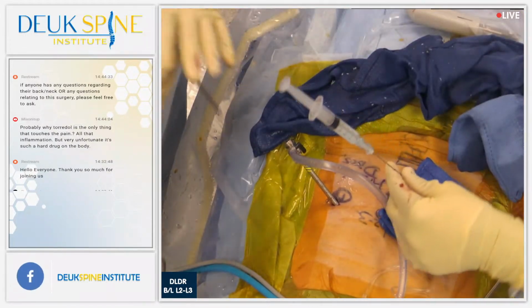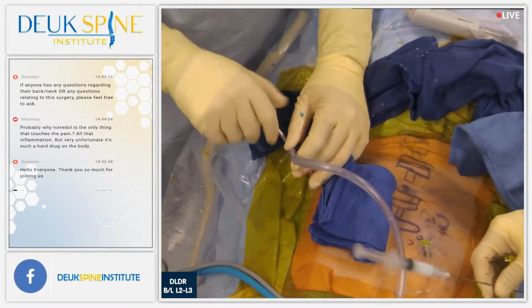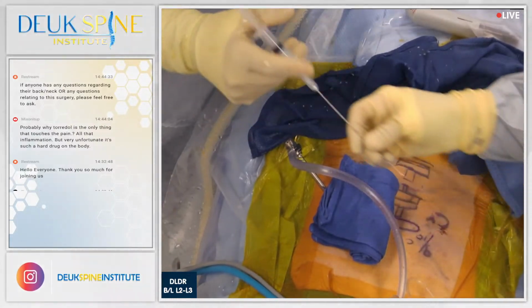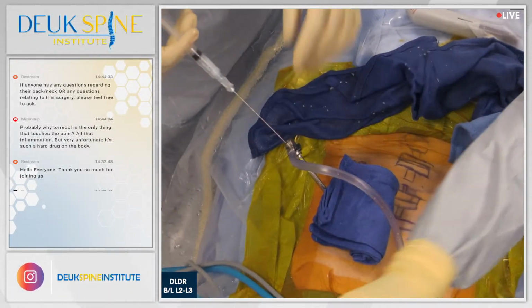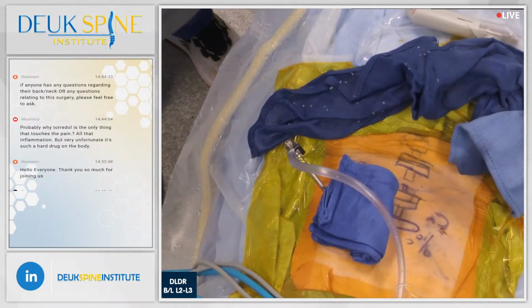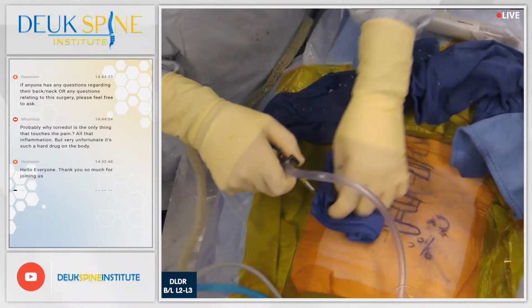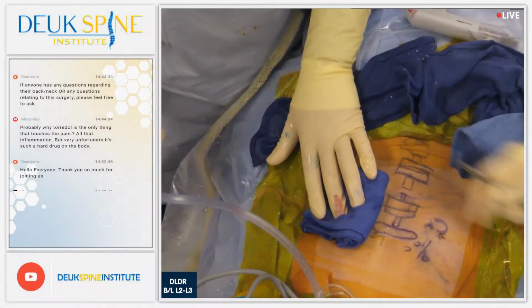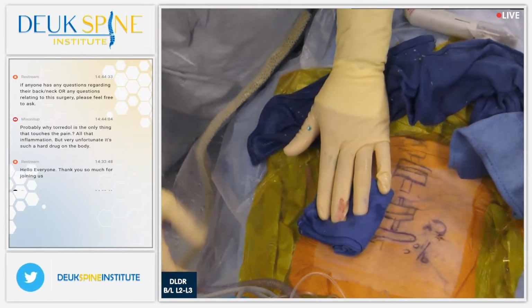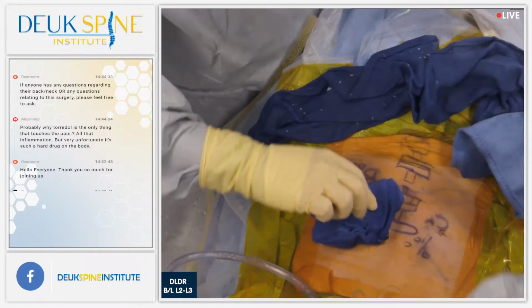But surgeons will tell you that you don't get the adjacent segment problem. They'll say you don't get that. Well, it's facet. It's behind the artificial disc. This is adjacent segment. But facet arthropathy is supposed to be a contraindication to artificial disc placement, but a lot of these surgeons will still do it anyway, even though there's facet arthropathy. And his arthropathy isn't that bad, so I don't really blame them for wanting to put in an artificial disc. But somebody should have recognized the facet pain and treated it by now. Somebody besides me. Okay. We're all done.